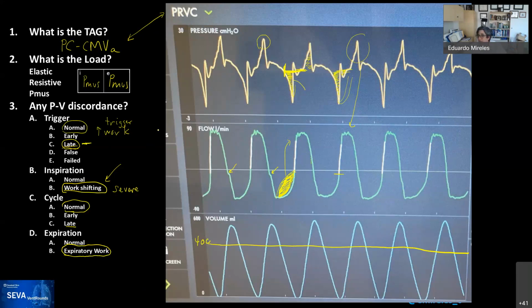So yeah, Dilip states these triggers need to be more intelligent, and the question is, I presume algorithms could detect this type of pattern to detect that the ventilator is triggering too late, and then automatically accelerate the triggering, or be preemptive and just shift the triggering ahead so that it could avoid that.